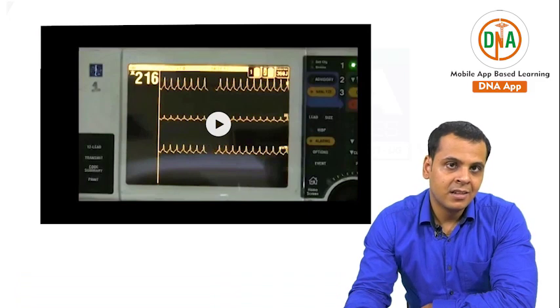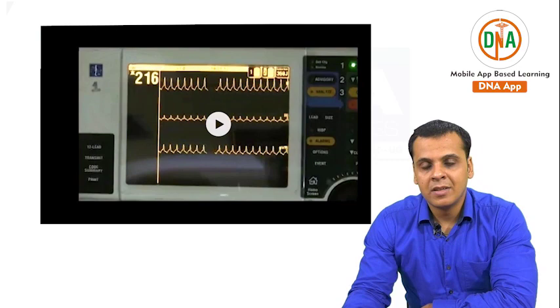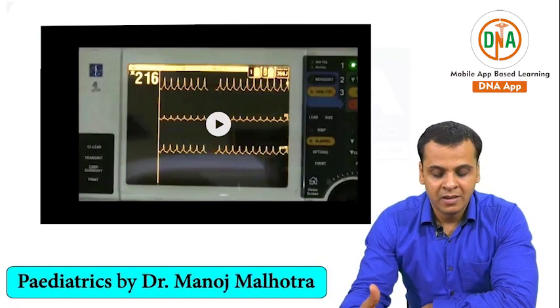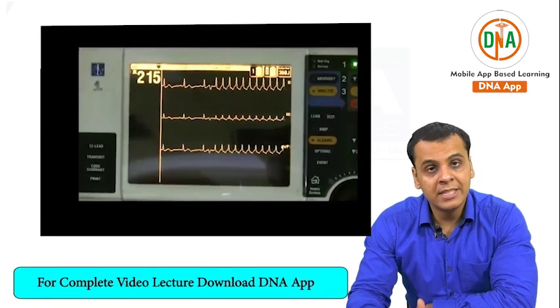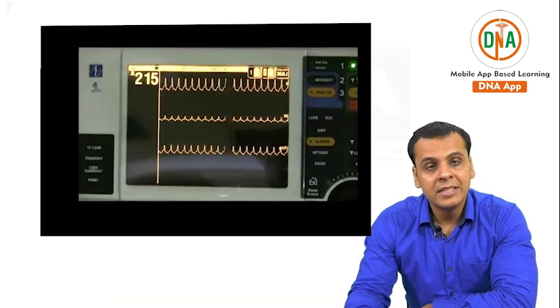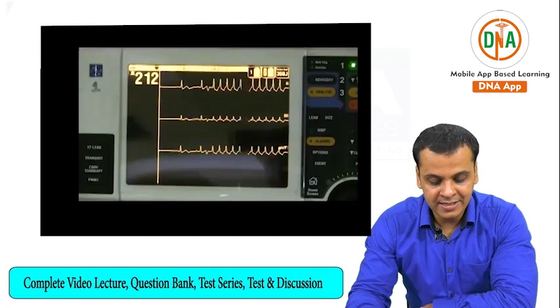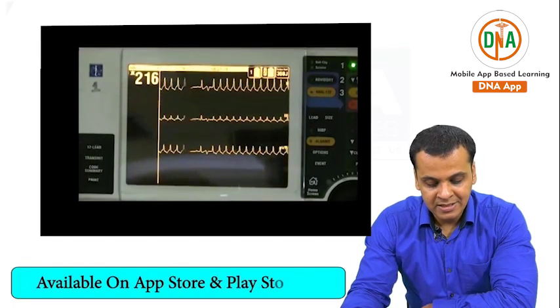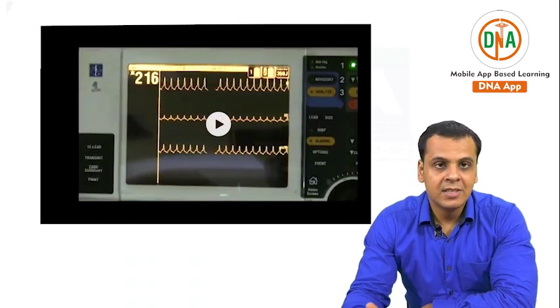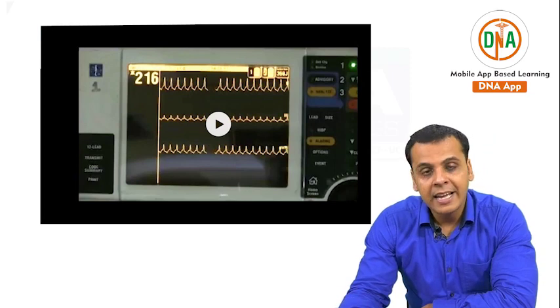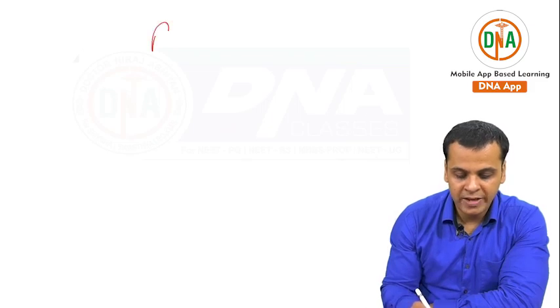Looking at this electrocardiographic monitoring of a patient, the heart rate initially was 72 and all of a sudden it became 215 — so it's a tachycardia. There are no P waves, as you can clearly see, and just a narrow complex QRS. This is a classical case of paroxysmal supraventricular tachycardia, PSVT.